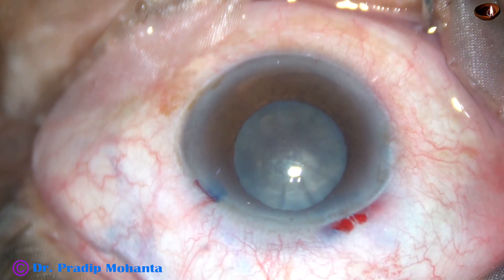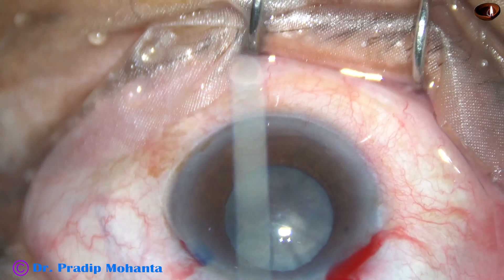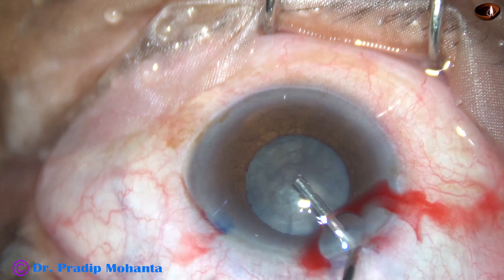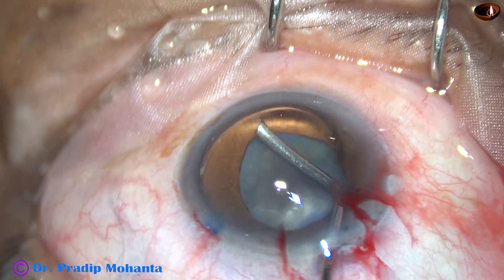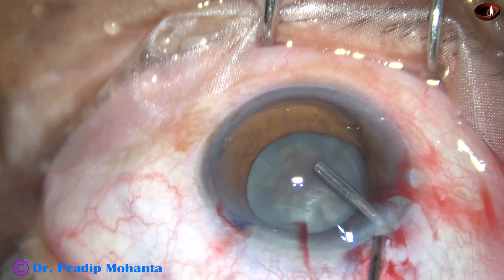And we can assume that as soon as we start chopping this nucleus, the pupil will become smaller in size. So I have planned to use a pupil expansion device in this case.